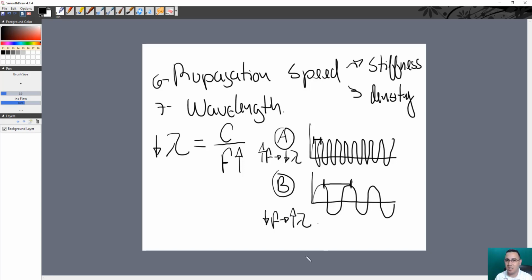So this relationship is really important, because later we're going to learn about the axial resolution, and the axial resolution is better when the frequency is high, which is going to result in a shorter spatial pulse length that we're going to study later.